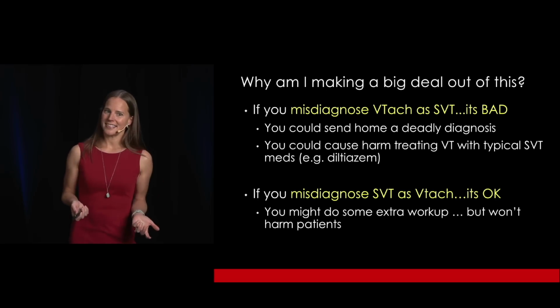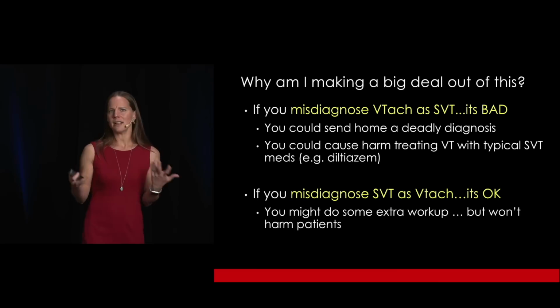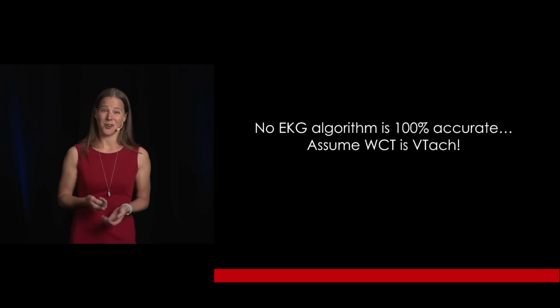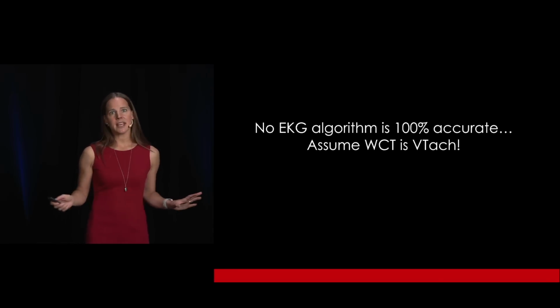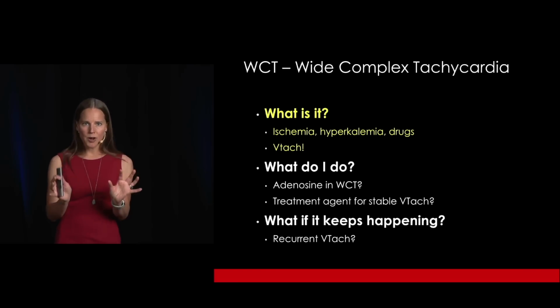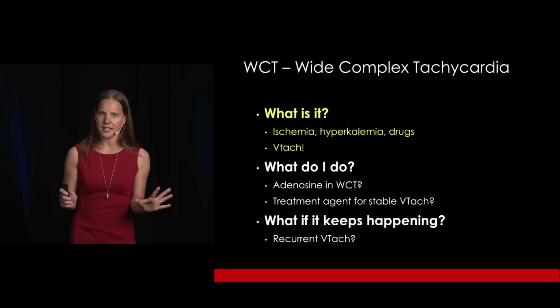On the other hand, if you misdiagnose SVT as VTAC, well, it's okay. You might do a little bit of an extra workup, but you won't harm patients, and you won't send home deadly diagnoses. So no ECG algorithm is 100% accurate. Just assume that if it's not ischemia, hyperkalemia, or drugs, it's VTAC. All right, so we have covered what is this wide complex tachycardia. It's going to be ischemia, hyperkalemia, drugs, or VTAC.